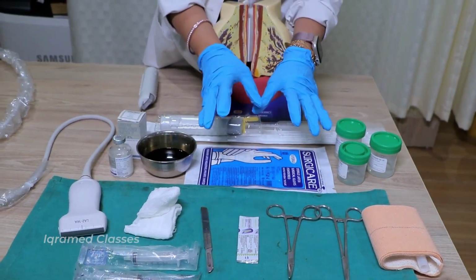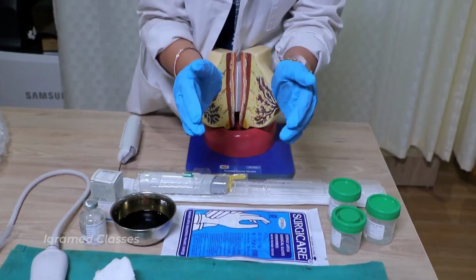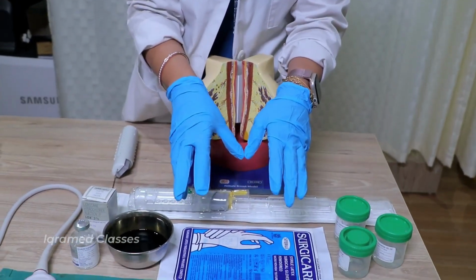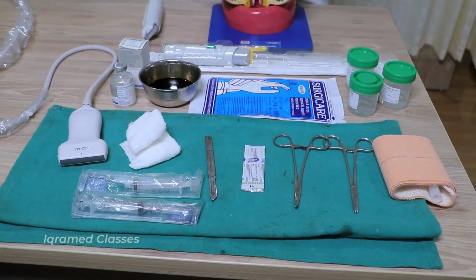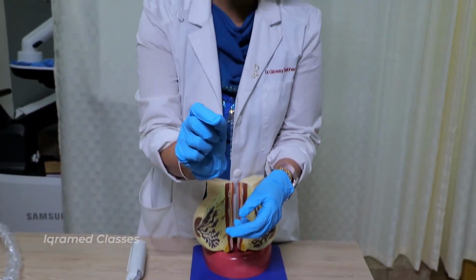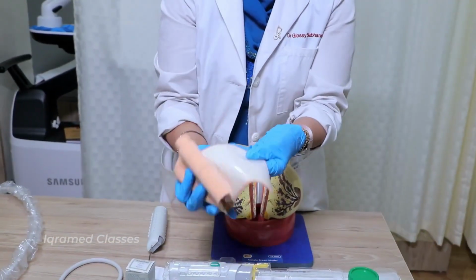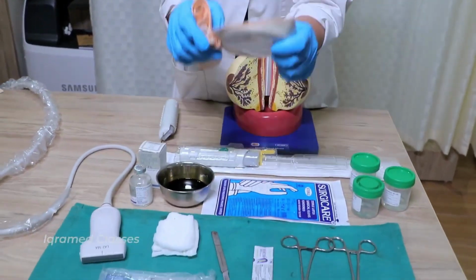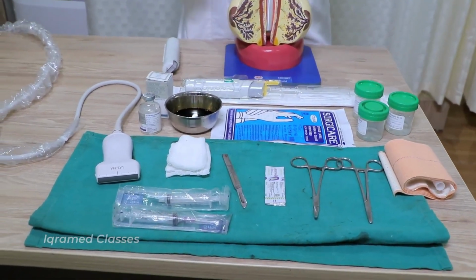After the biopsy sample is taken, how to control the bleeding? With the gauze piece, put pressure. You will put pressure for 2 to 5 minutes at least, depending on the thickness of the breast, how the bleeder is, how big the lesion was, how much nick you gave. After that, once you put the gauze piece over the surgical incision that you gave, you will put the Dynaplast because it gives pressure. We love to use Dynaplast. We put it over the gauze piece, secure it. It makes sure that the breast tissue does not move, and the patient does not have pain.